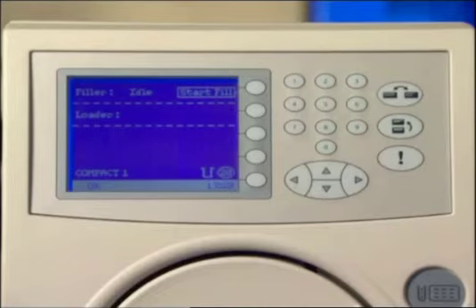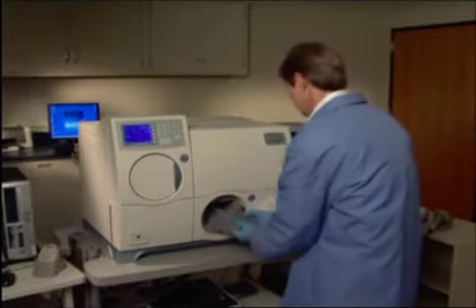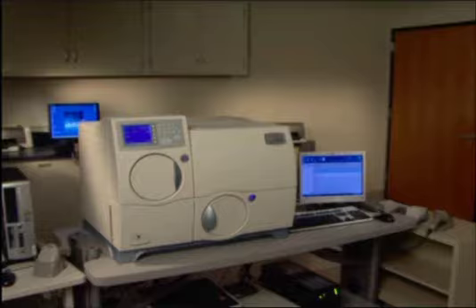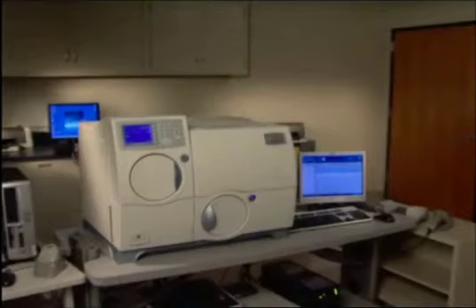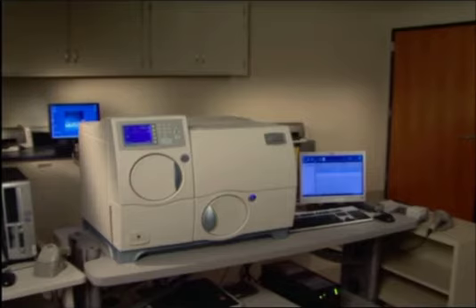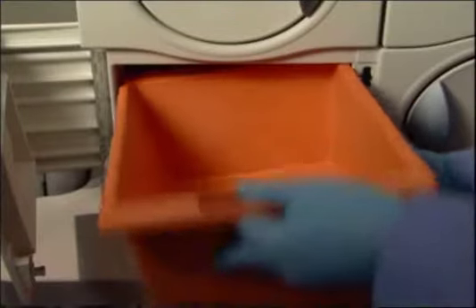You can view the QC status when the cassette is safely removed. Discard used tubes into a biohazard waste container. Test cards are loaded into the carousel. The load indicator above the load door blinks, and the door unlocks when loading is complete and the cassette can be removed. Daily or as needed, the used cassette should be removed from the load station as soon as test card loading is complete. Replace the bin and close the door.